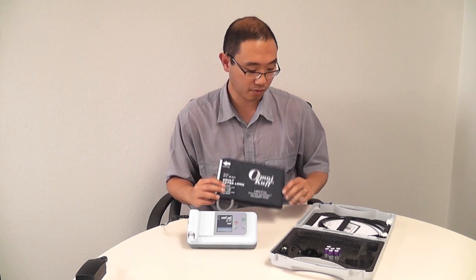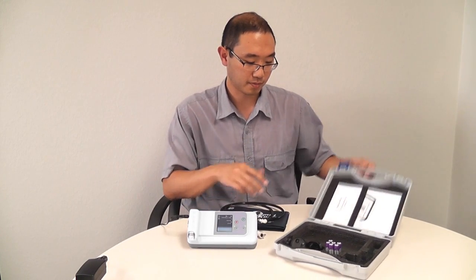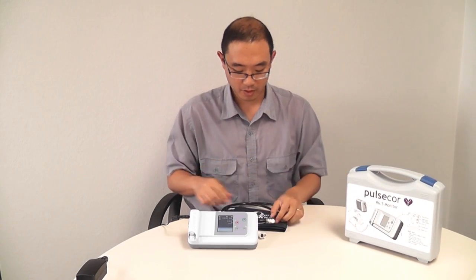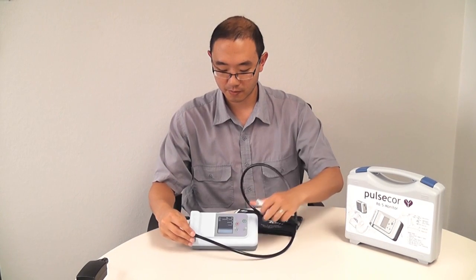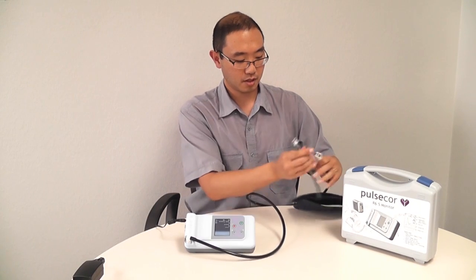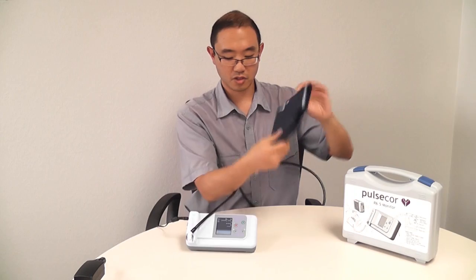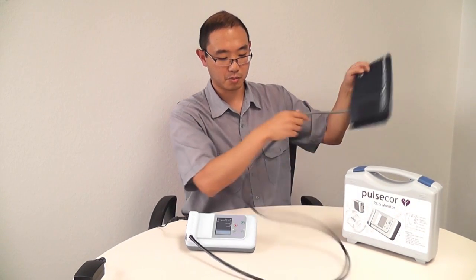In this case, we'll be using the adult cuff, along with an extension hose. The extension hose plugs into the device. We can plug the cuff into the extension hose, and then the cuff goes on to my arm, just like a normal blood pressure cuff.